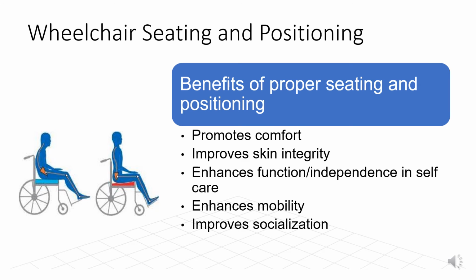Proper wheelchair positioning promotes skin integrity. It promotes comfort. It enhances function or independence in self-care performance. It enhances mobility, and it improves socialization and self-esteem.